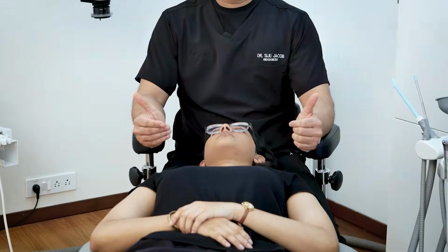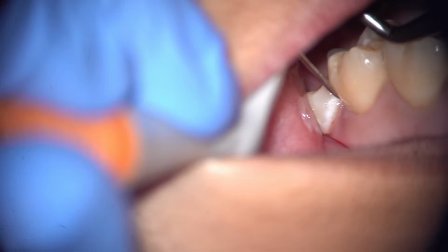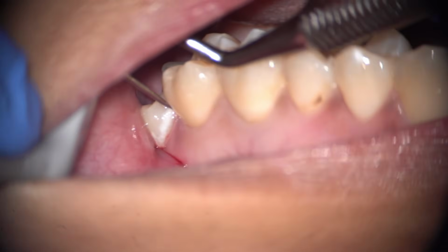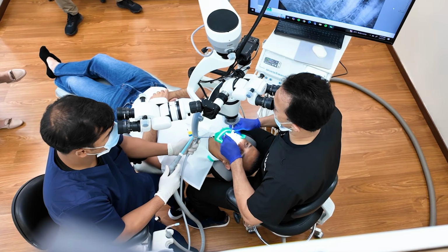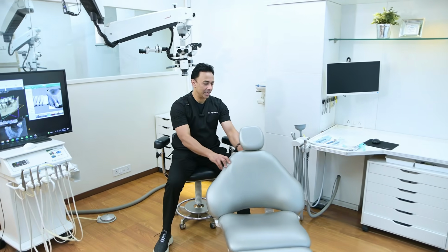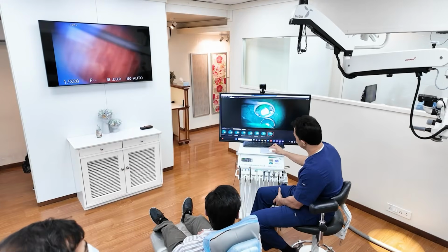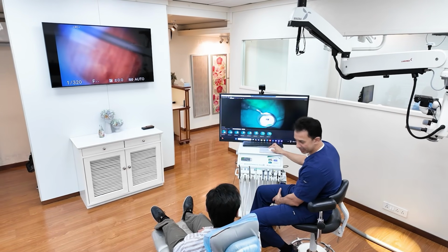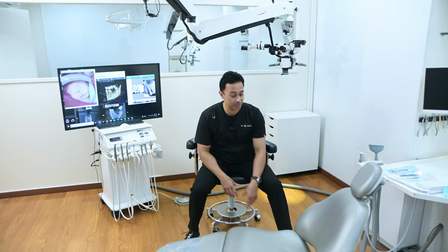And when you use a microscope, if you have a swivel chair, then you don't have to keep moving the microscope. The other big difference in a swivel chair is that, let's say you're working in one position, and once you're done with the procedure, you want to have a discussion with the patient, then you have this opportunity of just rotating the patient completely like this, and then make the patient face the cart. And then as you are explaining something, you can position the patient according to what you want. So the swivel really helps us in that way.